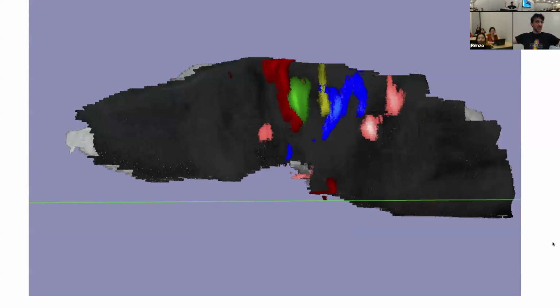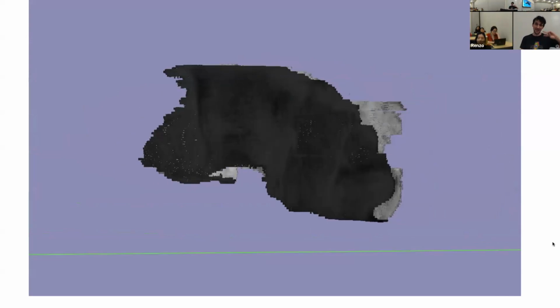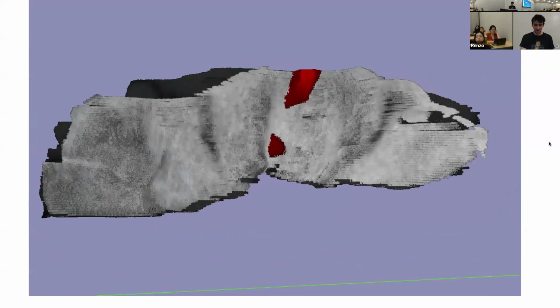And it's pretty gigantic. Like the huge chunk of the sensory cortex is responsible for these finger representations. And you don't really need extremely high resolutions for that. Now, the resolution comes in when you look at it on the other side, namely the motor cortex, where we have this little cave over here, the hand knob. And again, I'm projecting the individual fingers, the pinky finger.